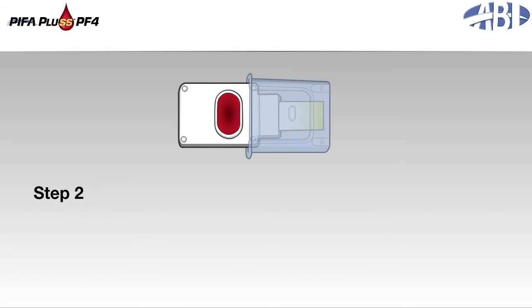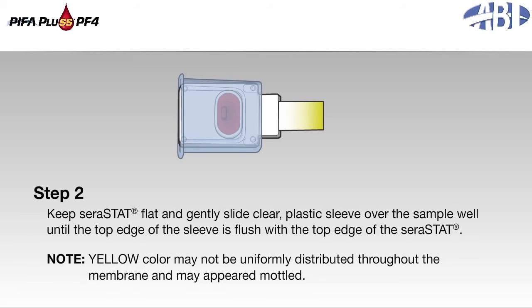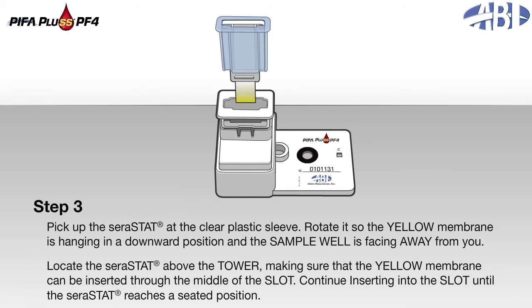Step 2: Keep the serastat flat and gently slide the clear plastic sleeve over the sample well until the top edge of the sleeve is flush with the top edge of the serastat. Note: yellow color may not be uniformly distributed through the membrane and may appear mottled. Step 3: Pick up the serastat by the clear plastic sleeve, rotate it so the yellow membrane is hanging in a downward position and the sample well is facing away from you. Locate the serastat above the tower, making sure that the yellow membrane can be inserted through the middle of the slot. Continue inserting into the slot until the serastat reaches a seated position.